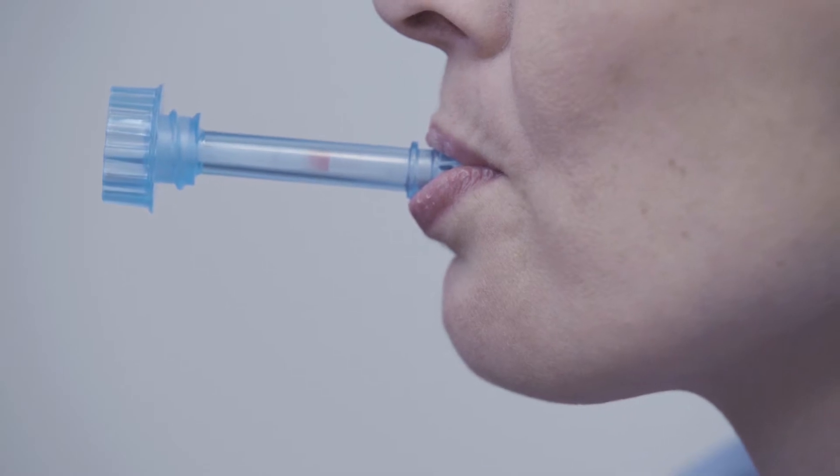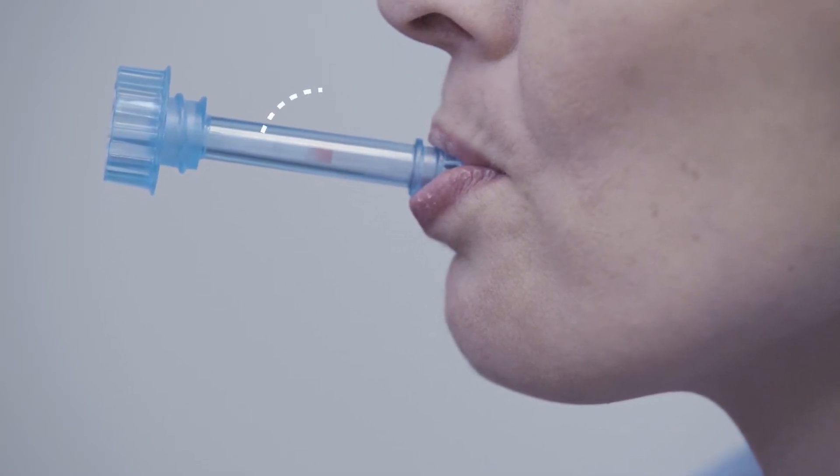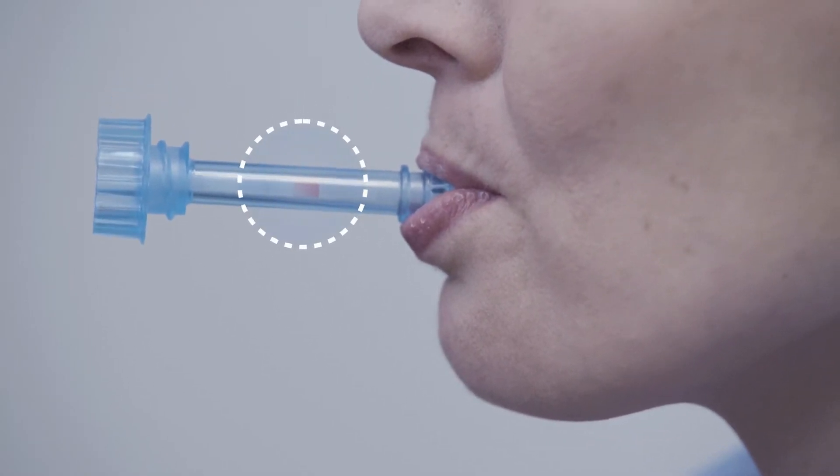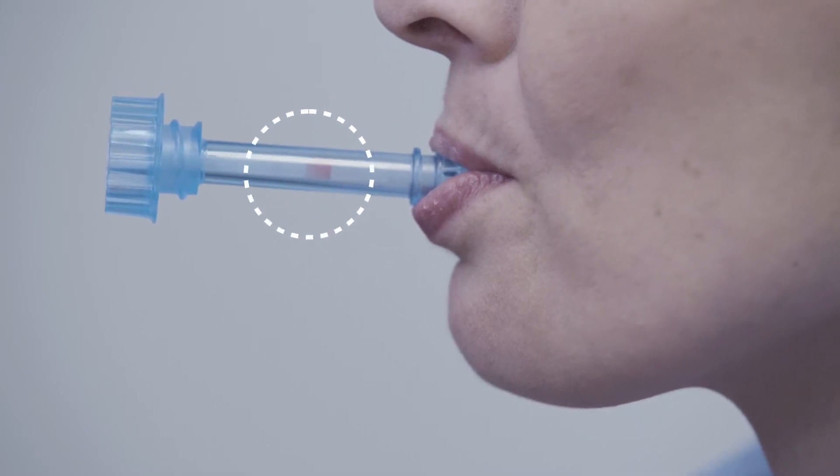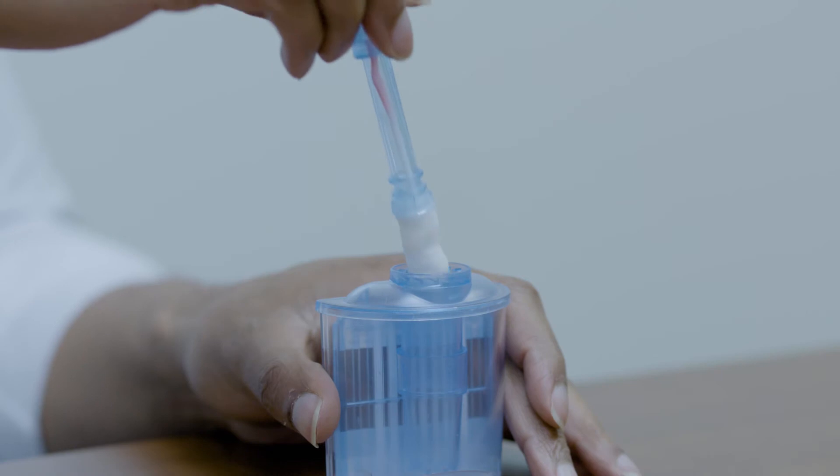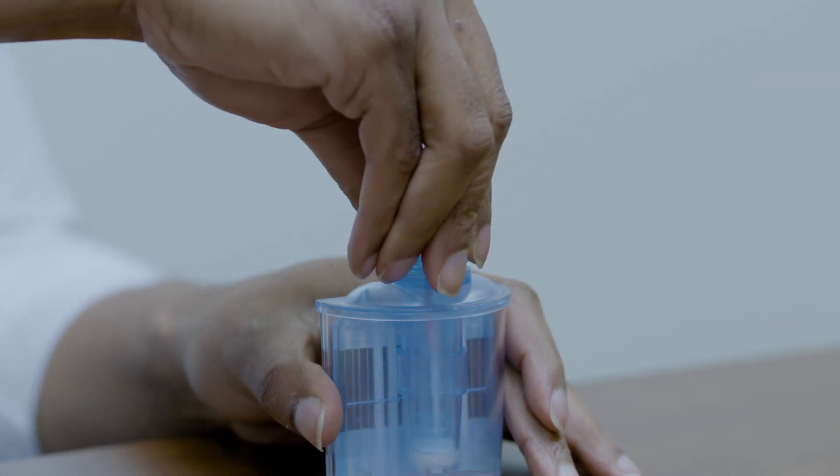This video shows color appearing on the indication strip inside the collection swab, which indicates there is a sufficient amount of oral fluid. Before testing, insert the collection swab, sponge first, into the device.